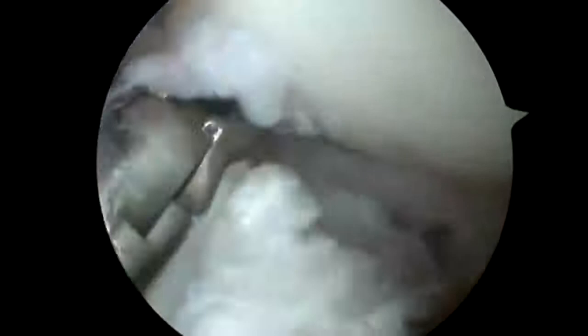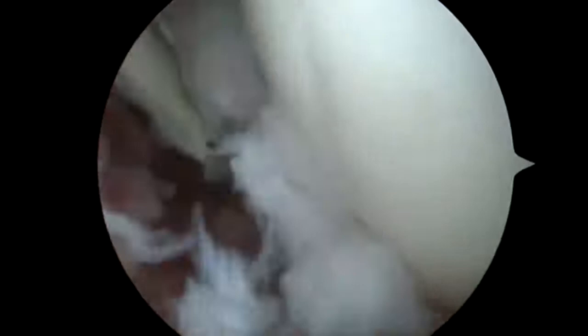I'm in the front of the shoulder now. The ball is on top and the socket is below, firmly opposed. And I am just cutting through this thick capsule that is scarred in too tight.